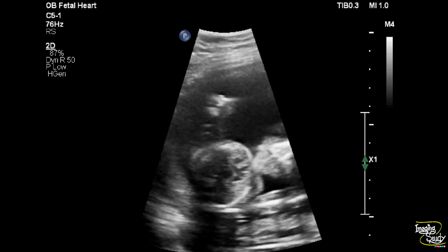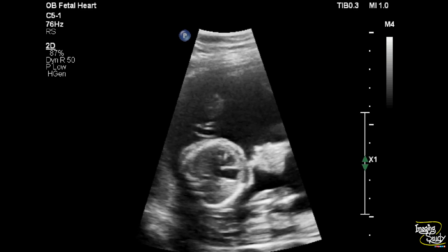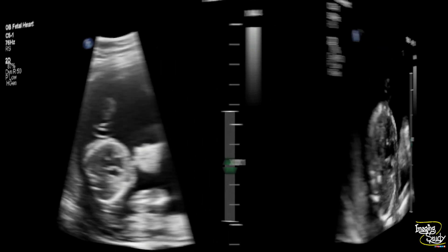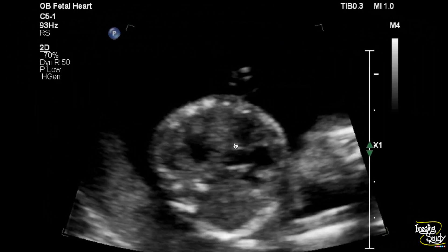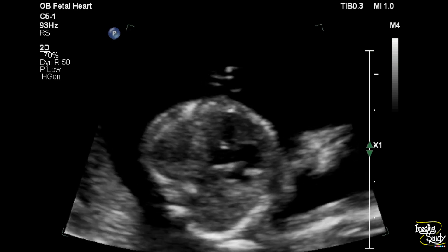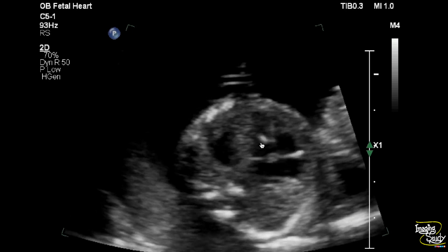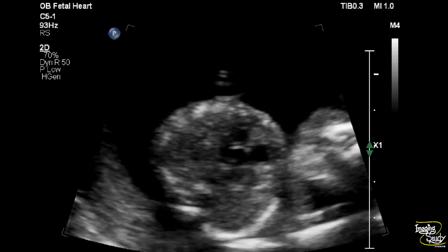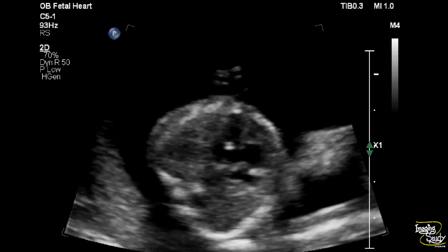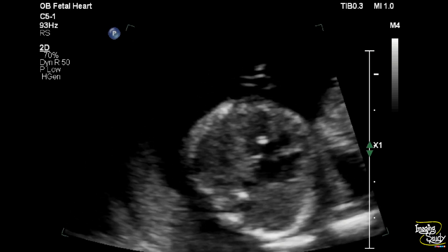Let's magnify the image a little more. Magnifying the image, you can see this hyperecogenic structure quite well visualized now. We scanned from different locations and the structure was still present. The ecogenicity of this focus is similar to the adjacent bone — you can see the spine and ribs are quite the same ecogenicity as this structure. Usually we get this ecogenic focus when the papillary muscles get mineralized.